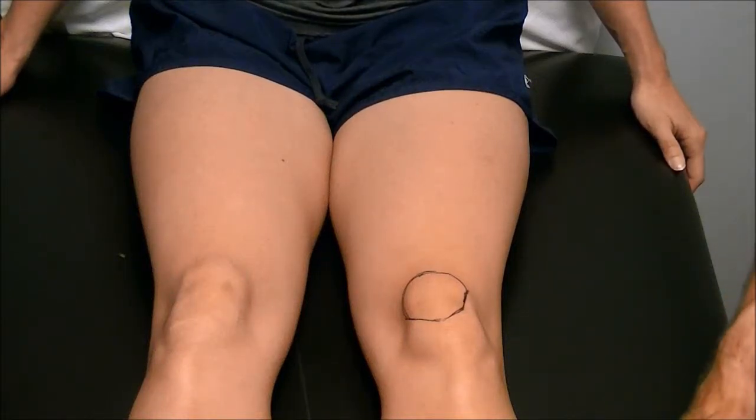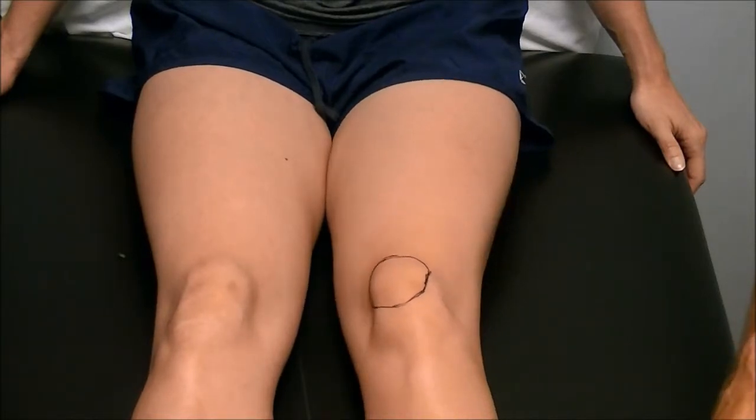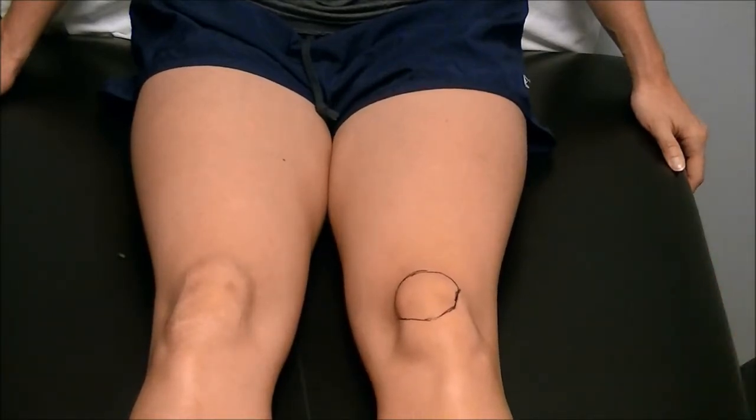Welcome back. Now we're going to show you the McConnell Taping Technique. This taping technique was invented by a lady out of New Zealand named Pat McConnell. I met her in Hilton Head one year.